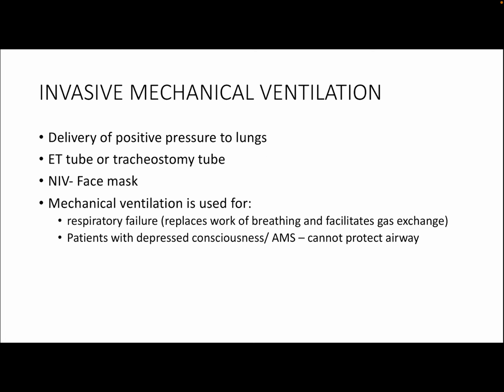Hello everyone, so I'll be talking about mechanical ventilation. In this video, I shall focus on invasive mechanical ventilation. I'll try to cover certain concepts in mechanical ventilation, the ventilator settings in ARDS and COPD specifically, a little about weaning off of the ventilator, and finally about the role of PEEP in congestive heart failure.